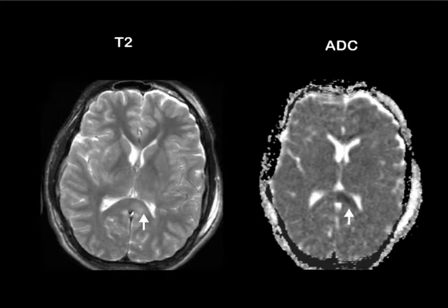And what about diffusion-weighted imaging? We talked a little bit about diffusion-weighted imaging in the prior talk on anoxia. And here you can see this is an individual who had a traumatic brain injury. You can see that on T2, you perhaps begin to identify a hyperintense signal here in the splenium of the corpus callosum, but it's much more apparent using this ADC. And here you have a hypointense signal. This suggests that there is cytotoxic edema and indicates that there has been a significant lesion in the corpus callosum, a very characteristic location for diffuse axonal injury.